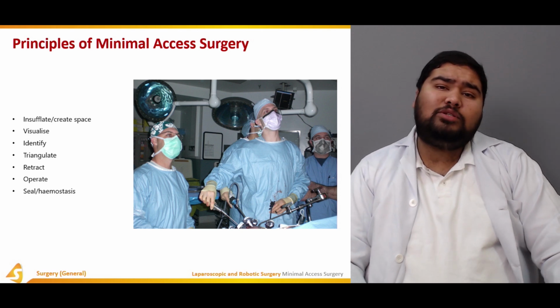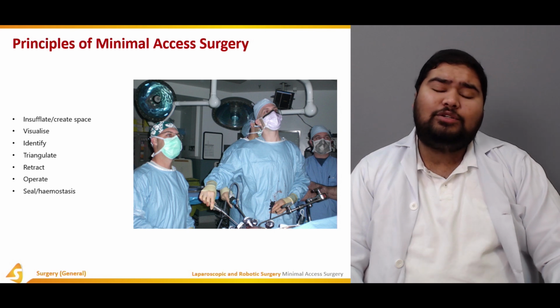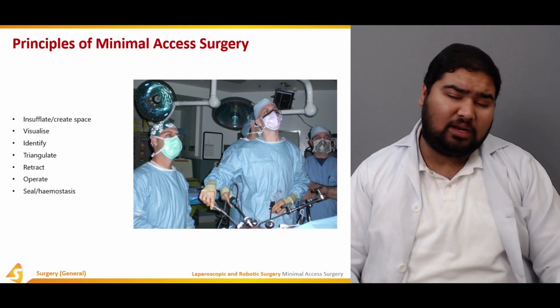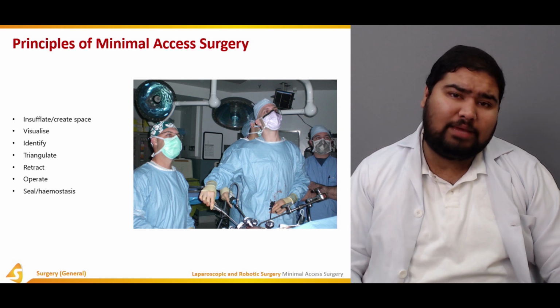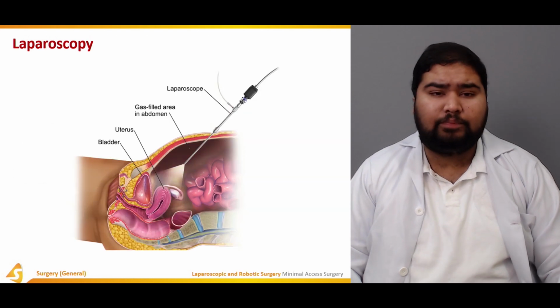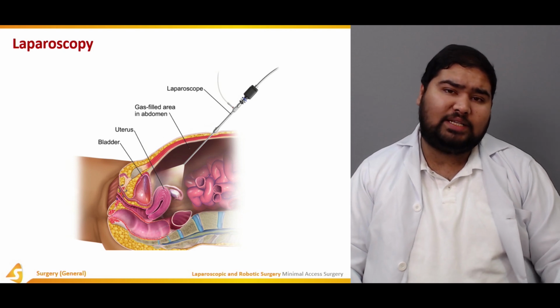Then you should be able to seal or secure the hemostasis. Sealing or securing the hemostasis is the most important component of a surgery. You've performed a resection, but now you have to seal or secure the hemostasis, and that you should be able to do after the operation. So these were some of the steps of minimally invasive surgery.